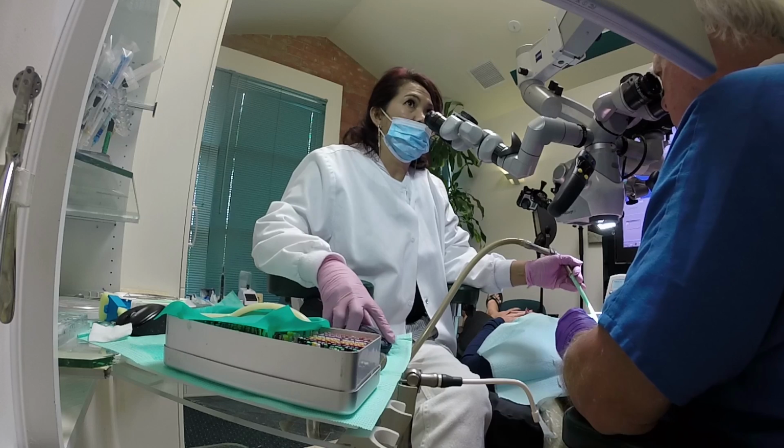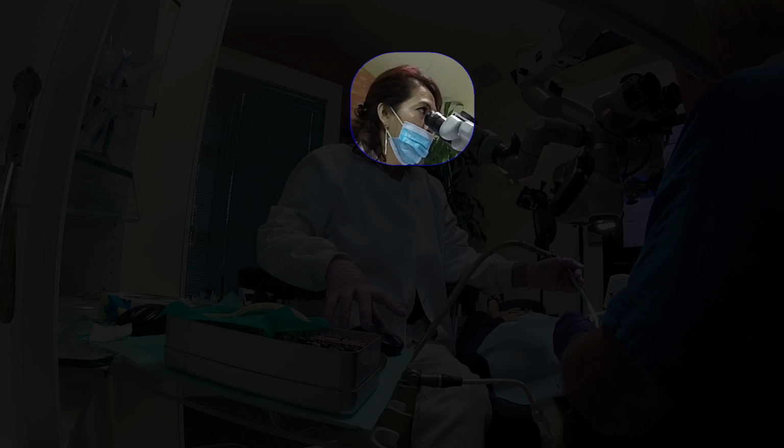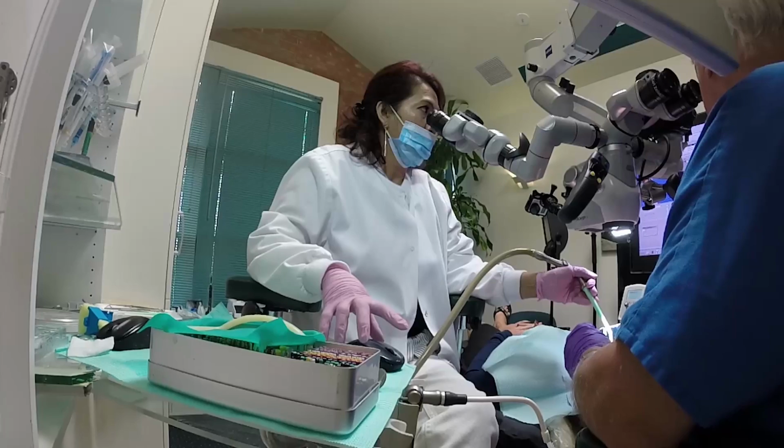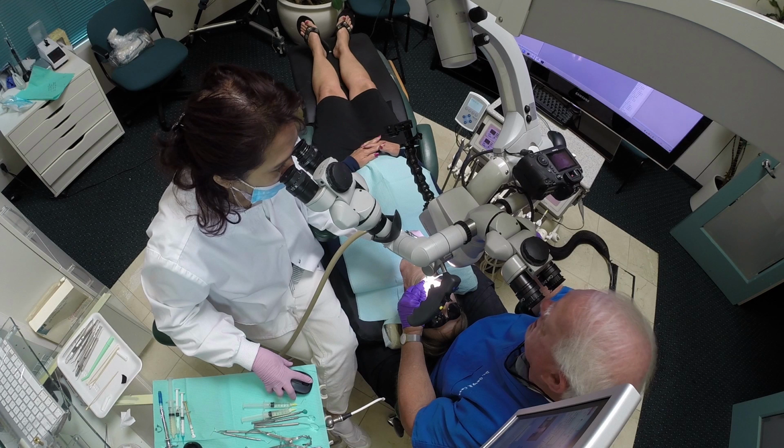She grabs the mouse, and you can see what she's doing with her eyes. Notice her arm. It's completely relaxed. Looking at her eyes, she's able to look through the microscope and at the monitor to acquire the picture. Notice where her right hand is on the mouse, ready to take a picture. So the ergonomic placement of the monitor is very important. If she has to turn her head, then this gets much, much more difficult. She just took one picture, and now she's going to take a whole series of pictures here. And you want to make this as effortless as you possibly can.